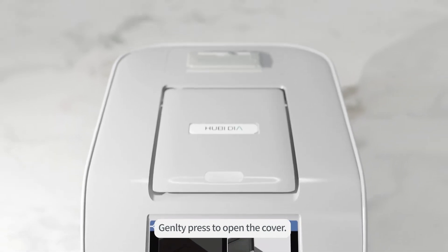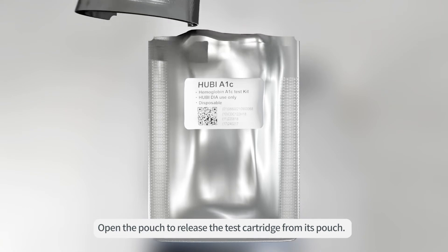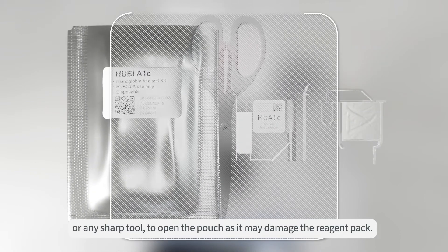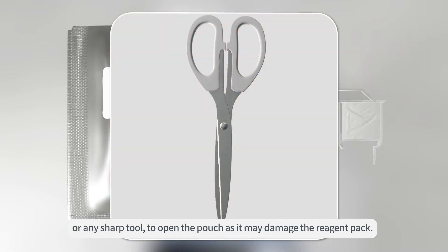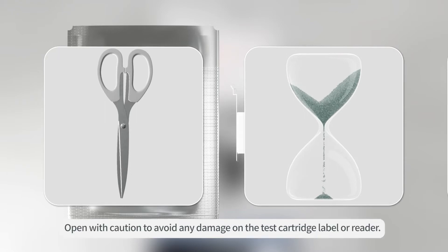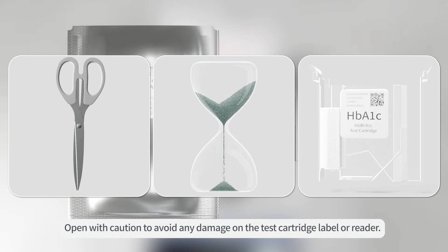Gently press to open the cover. Open the pouch to release the test cartridge from its pouch. Do not use a knife or any sharp tool to open the pouch as it may damage the reagent pack. Use immediately after opening. Open with caution to avoid any damage on the test cartridge label or reader.